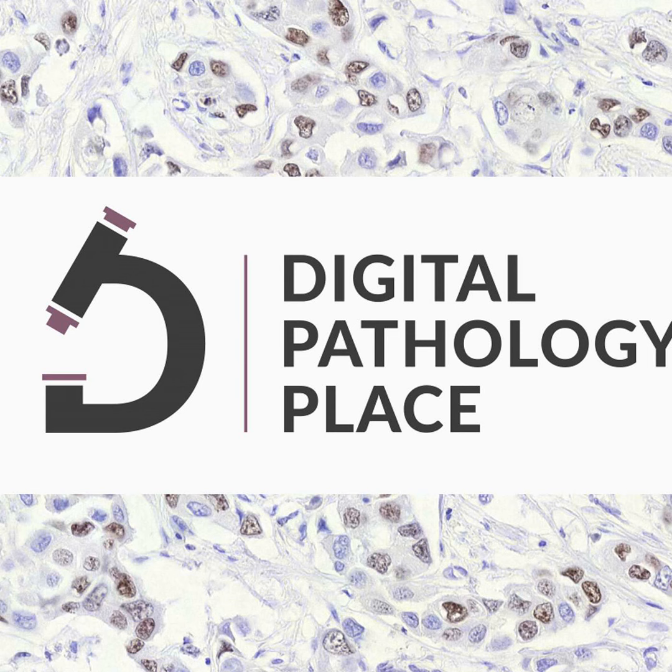What can multiplex be used for? It is a technology that enables us to visualize multiple biomarkers in the tissue, but what would be the applications at the moment? Sure. I think that the main reason for doing multiplex is so you can start phenotyping all of the individual cells in the tissue. And really, the advantage of being able to do it in tissue as opposed to other flow cytometry techniques is because you can actually see the spatial relationship and the context in which the cells are participating in that tissue.